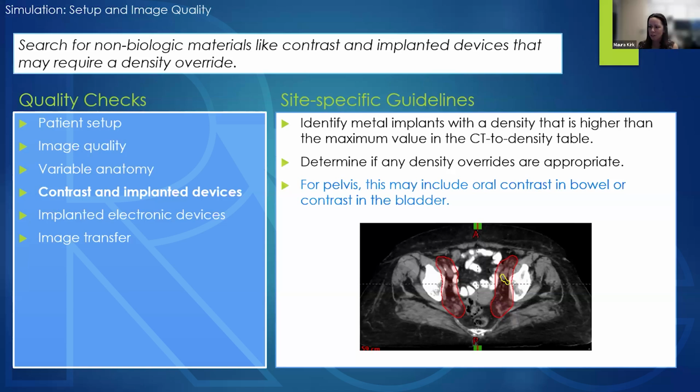Yeah, that's a great question. I do not know the answer specifically for Monaco, and I wonder if there's general image editing software freely available that could do something like that. I'm not sure of the answer to that. Yeah, me neither. We use MIM to do it, and MIM has a special workflow you can use.